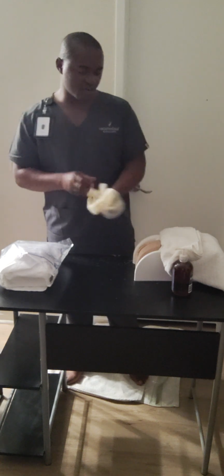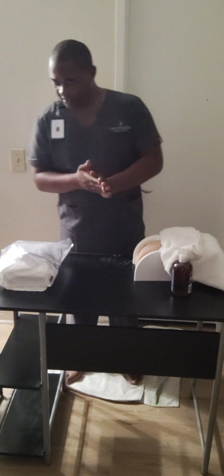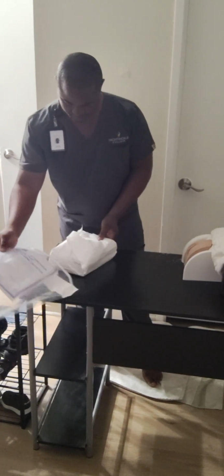So I'll go ahead and take off my gloves, put that in the trash, perform hand hygiene, and I'm going to grab my catheterization kit. I could use this like my trash, or I can toss this. So I'm going to open my kit from the furthest, and then the sides, and then the one closest to me.